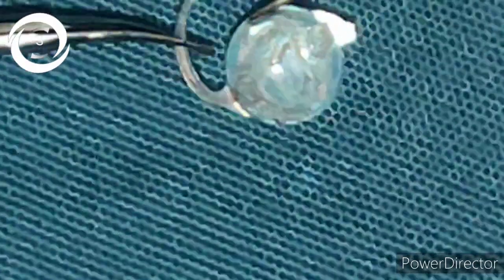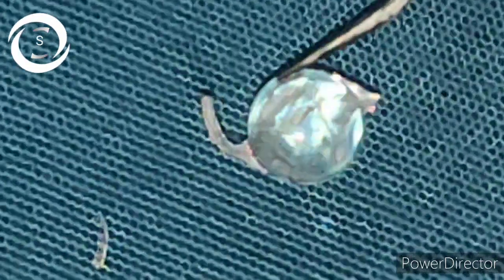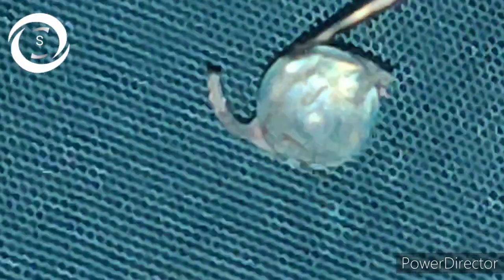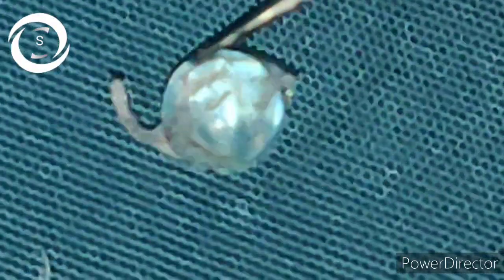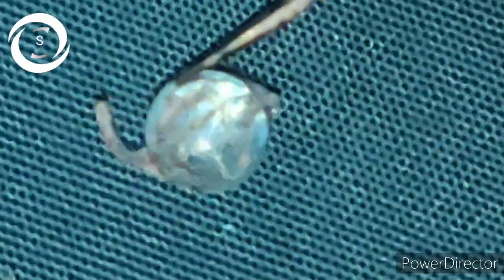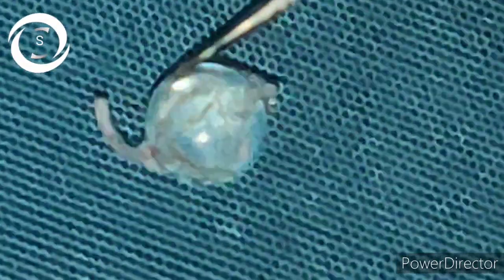But if more than half the haptic is missing, it should be replaced. As you can see here, on one side the full haptic is broken — in that case you should replace the IOL. On the other hand, if half the haptic is broken, it still gives support when implanted in the bag. So if one is a full haptic and one is a half haptic, you can safely implant it. But if more than half the haptic is missing, you should replace it.